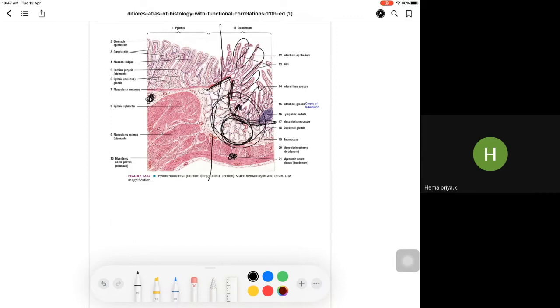To say it is ileum, you have to see the Peyer's patches. You all know the lymphoid aggregates, which are a normal component here, whereas elsewhere lymphoid nodules are usually abnormal. So by looking at the submucosal glands, we can say it's a duodenum. By looking at the lymphoid aggregates, we can say it is ileum. Jejunum doesn't have any specific finding. And when you think about it logically, it's very difficult to take a jejunal biopsy, because the duodenum they can reach from the stomach, and the ileum they can reach from the cecum when doing colonoscopy. But the jejunum usually cannot be biopsied.